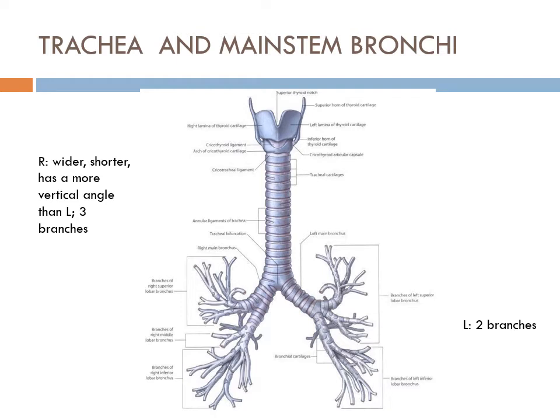When you're trying to place a double lumen tube, or a bronchial blocker, it is actually pretty hard to place sometimes. It's always going to want to go on the right side. So why is that? These are questions we're going to ask you to understand the anatomy of what's going on, because it's a reason why you're having a true struggle with putting in the tube. And it might buy you a little more time to be able to place the tube without it getting taken away from you, because you answered all the questions there.